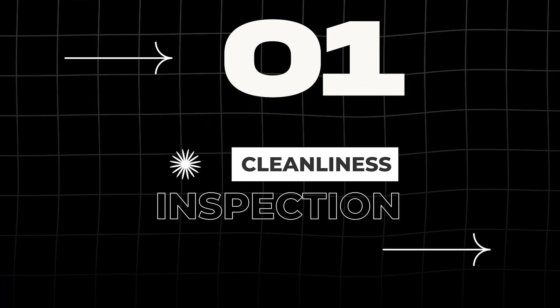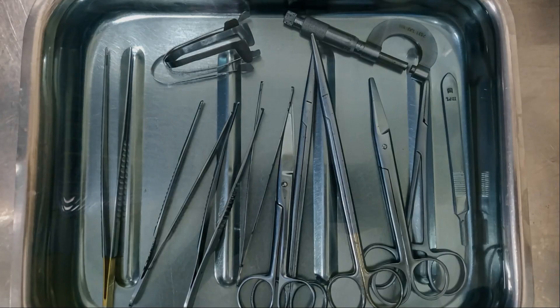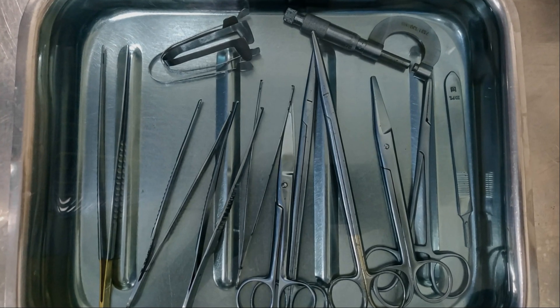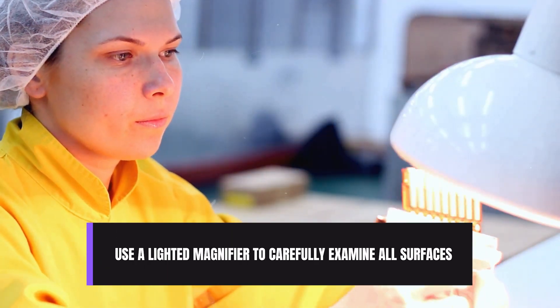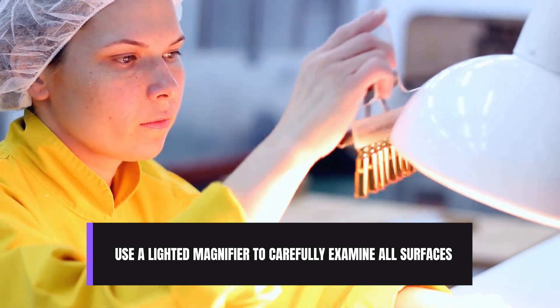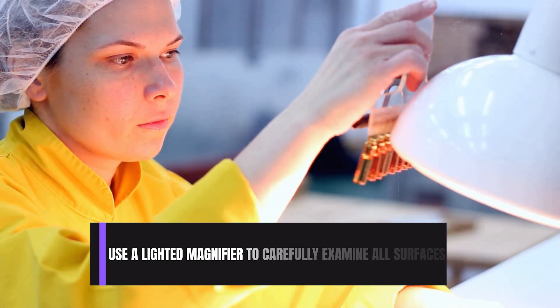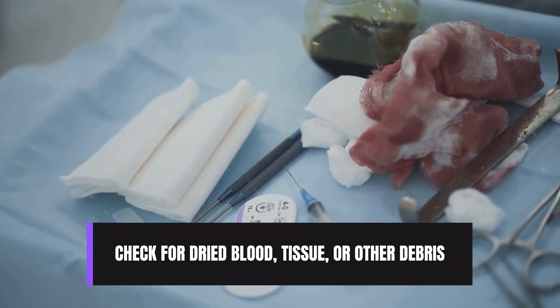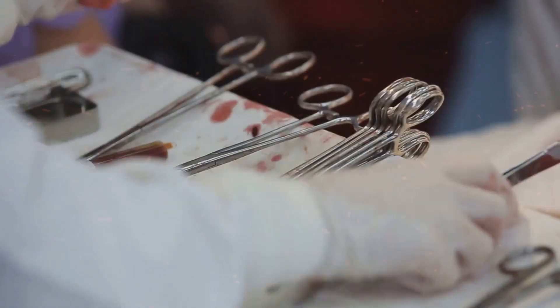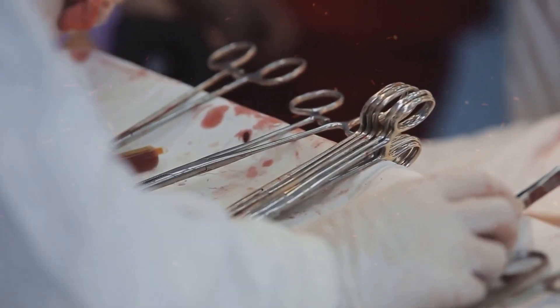First, cleanliness inspection. Even the smallest residue can compromise sterilization and pose a risk to patients. Use a lighted magnifier to carefully examine all surfaces of the instrument, paying special attention to hinges, box locks, and serrations. Check for dried blood, tissue, and other debris. Stains should not be confused with residual bioburden. When in doubt, re-clean the instrument.